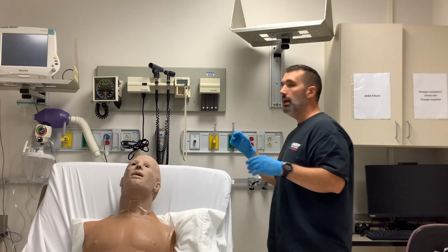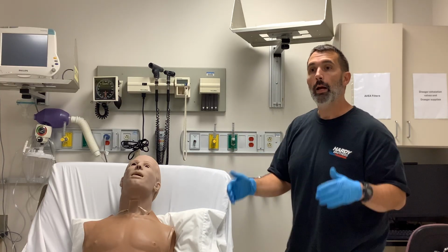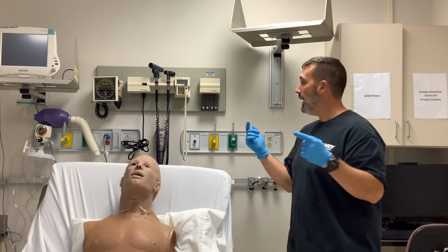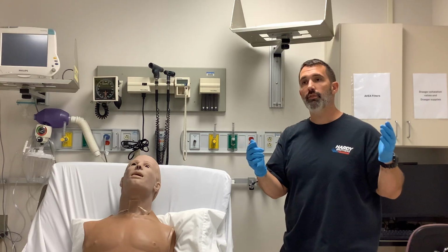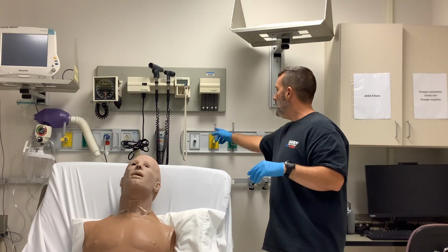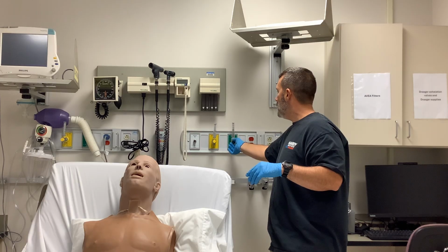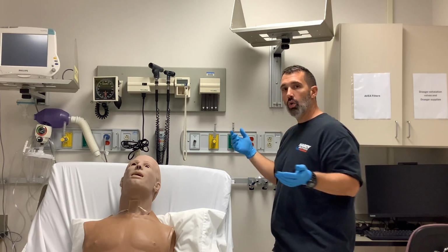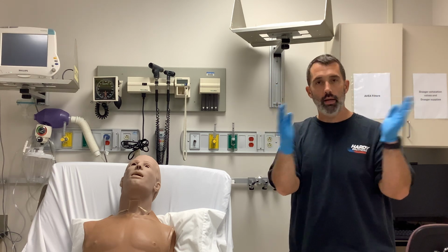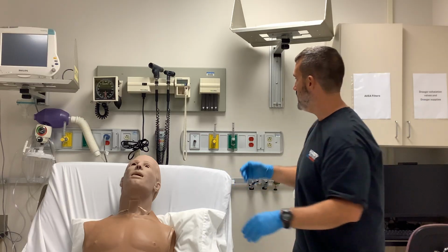Let's say I needed to bump his amount of oxygen up to 60%. Now I need to know that that's a 1-to-1 ratio. And let's say that I need his inspiratory flow at this point to be 18 liters per minute. All I have to do is leave the air at 9 and take the oxygen up to 9. That gives me a total flow of 18. I am matching every 1 liter of oxygen with 1 liter of air at a 1-to-1 ratio. If I analyze that, it should in theory be 60%.